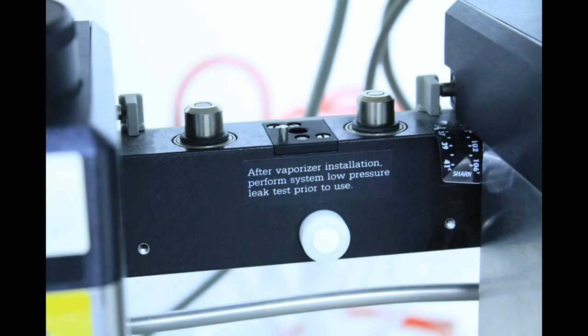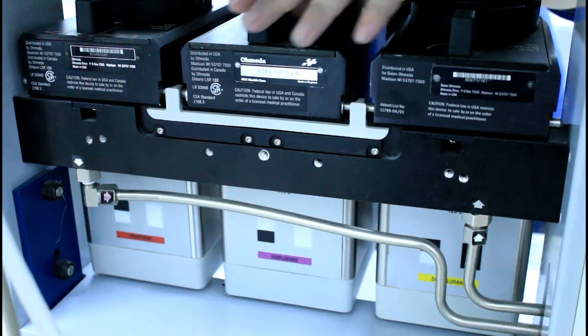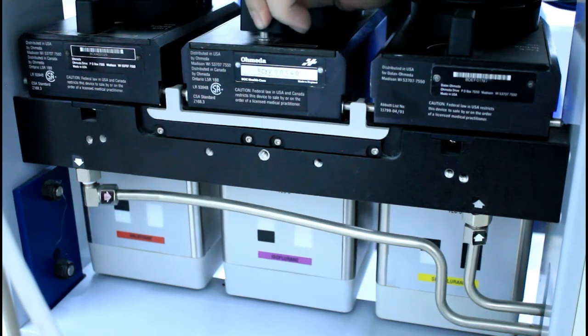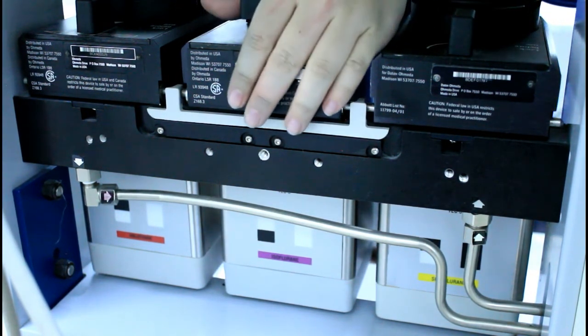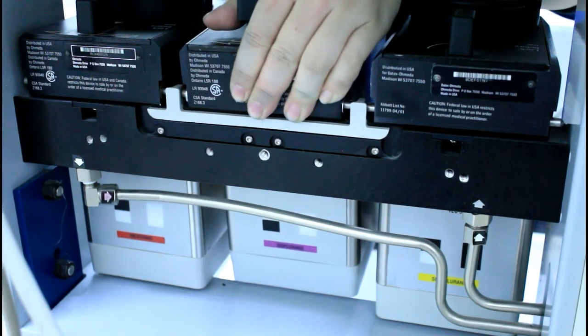The O-rings are located at the point where the vaporizer connects with the anesthesia machine to seal the connector and prevent leaks. O-rings will only be accessible when the vaporizer is removed from the anesthesia machine, which can be done by unlocking it and then lifting it off. Please note that vaporizers are heavy.